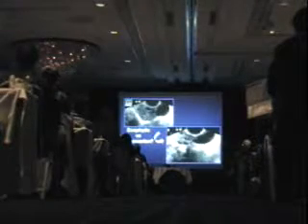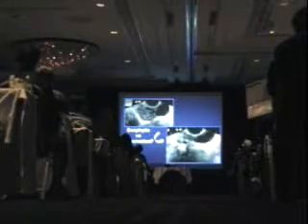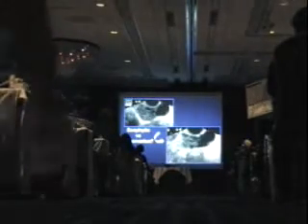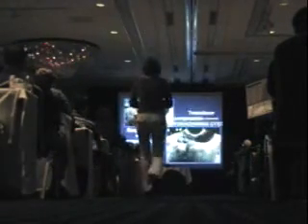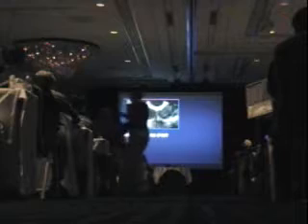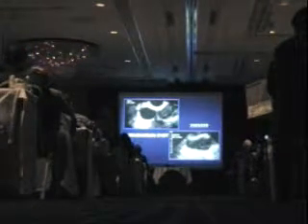I certainly wouldn't get anything worried about this until it's at least over 5 centimeters. That's usually, again, that cutoff. And then sometimes they can torse, but it's quite unusual. So relax when you see something that's para-ovarian. Now, here's another patient, very clearly a separate, simple-looking para-ovarian cyst.